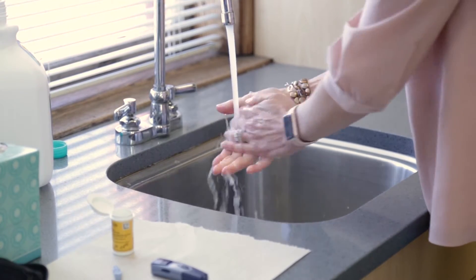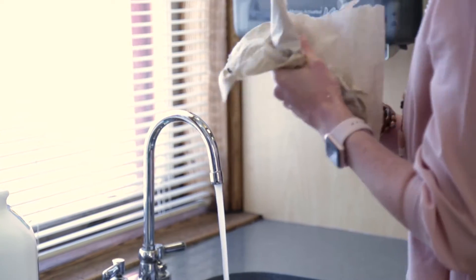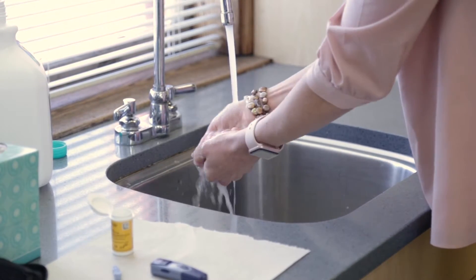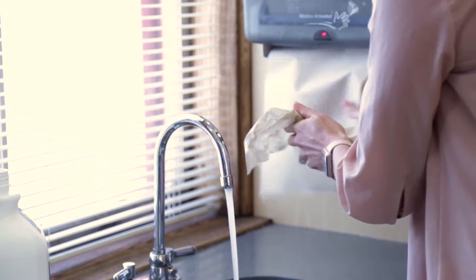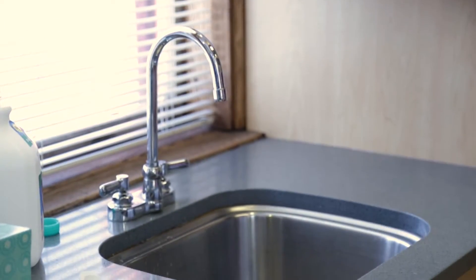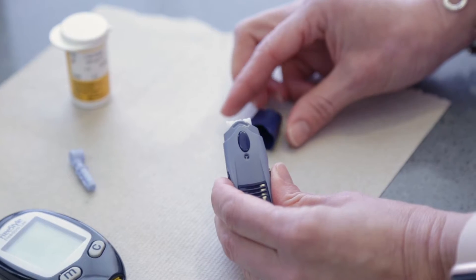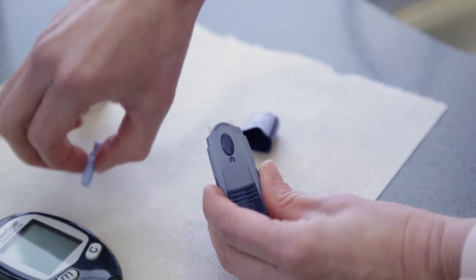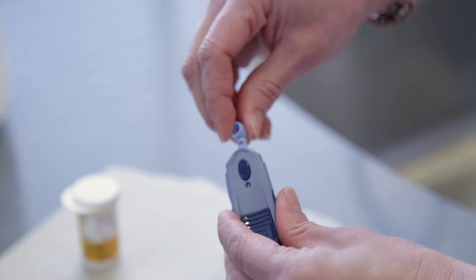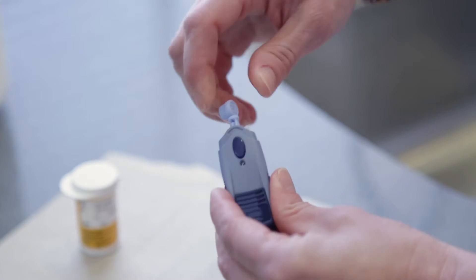Prior to testing, wash your hands with warm soap and water, then dry your hands with a clean towel. To start, twist off the end cap of the lancet device. Insert the lancet and then gently twist off the lancet cap to expose the needle. Replace the lancet device cap and pull back the trigger, and then set aside.